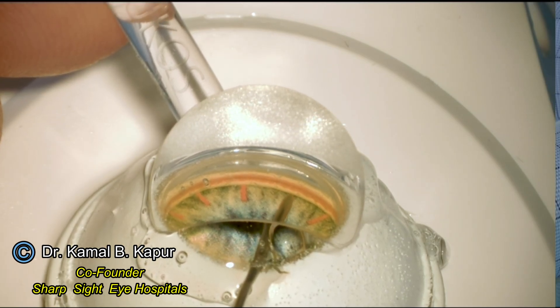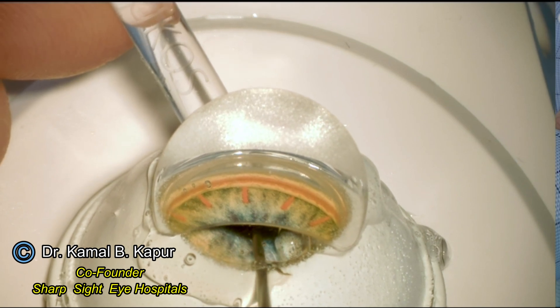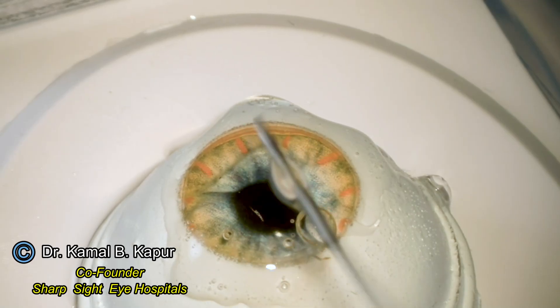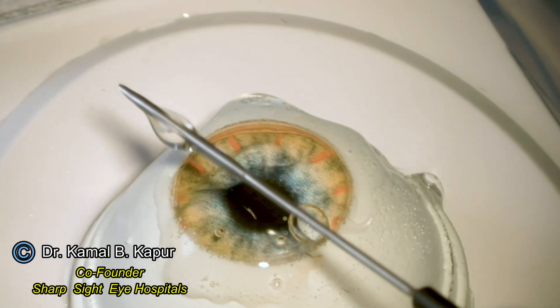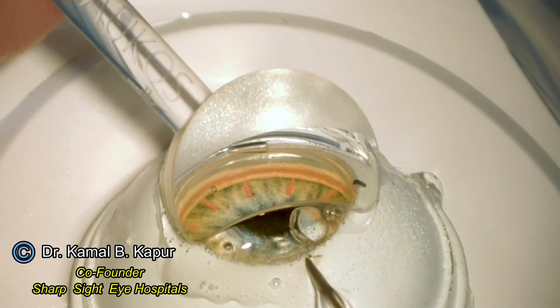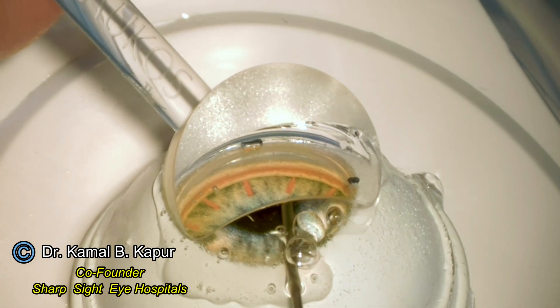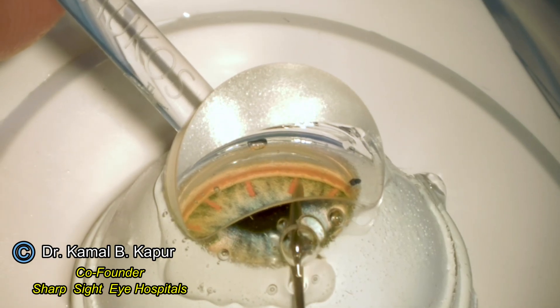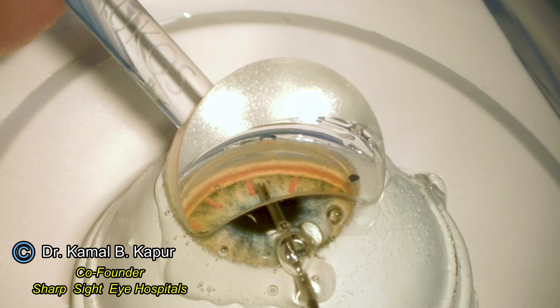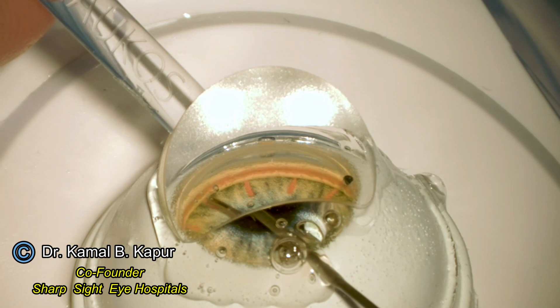After visualization of the trabecular meshwork, the retractor is pulled back which unsheathes the firing pin. The direction of insertion of the plunger has to be absolutely straight to the area where you want to inject the stent. If there is a discrepancy between the area of injection and the angle of entry, it may cause a bias, misfiring, or half-embedding of the eye stent.